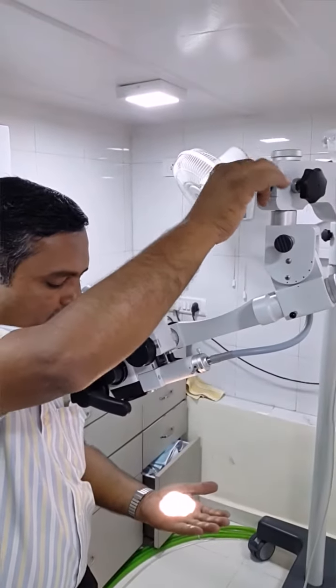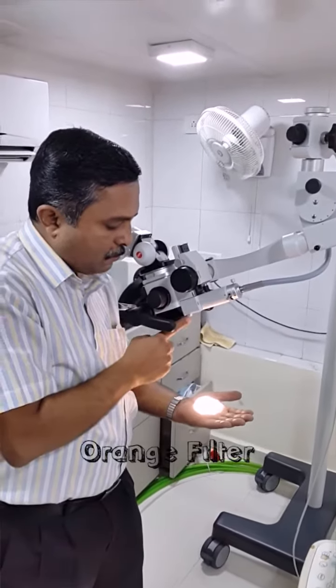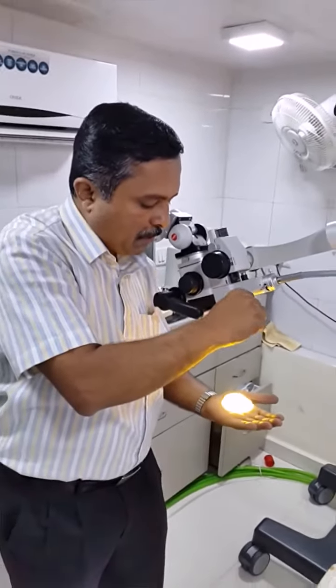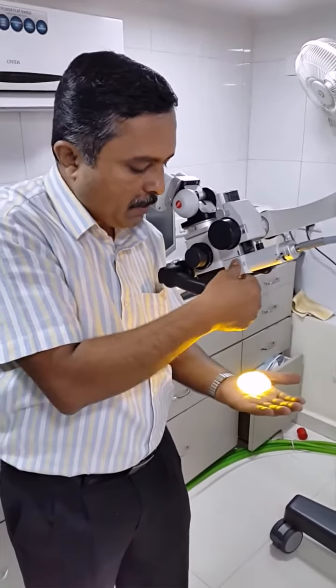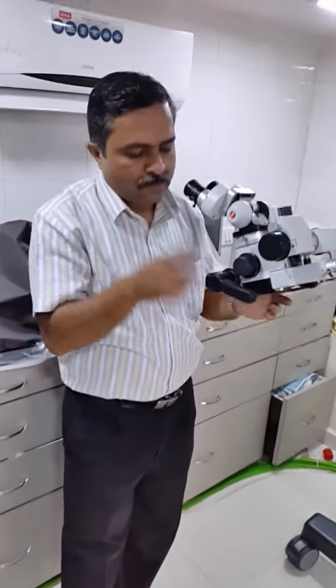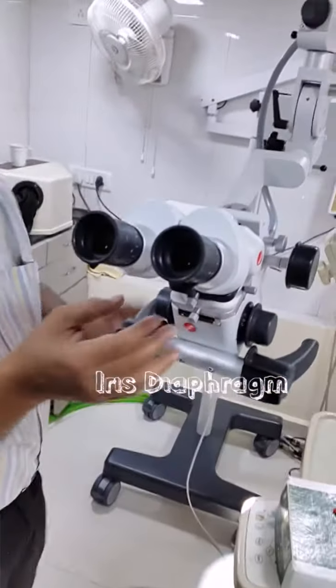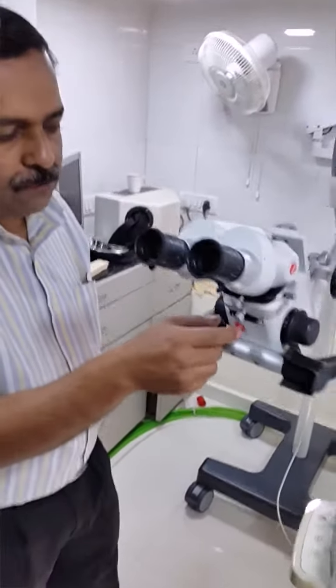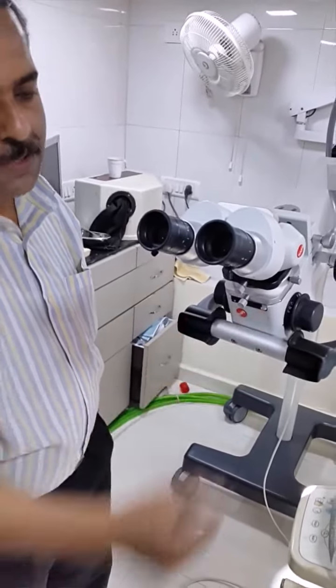Here is the illumination intensity control knob. This small piece is an orange filter. If you want to activate it, you can take it to 90 degrees — it has only a 90-degree movement, and this is the normal position. Five-step magnification is there. This is the iris mechanism: during any deep procedure, you can adjust the depth of focus by adjusting this iris knob. In normal position it is to be at the higher side — bigger aperture.